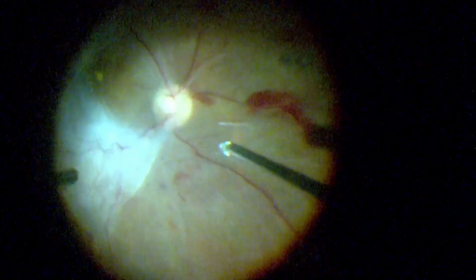Once you have done this dissection, then you could use any of the instruments, either a cutter or a scissors, to help you remove this fibrovascular tissue, and the membrane dissects very easily. Here is another example wherein just a blunt dissection would help you remove these membranes.